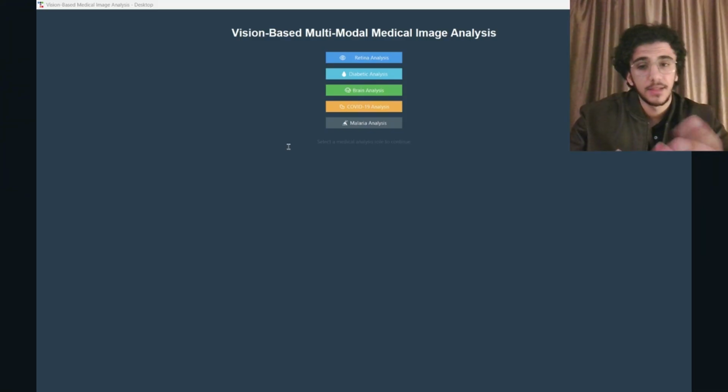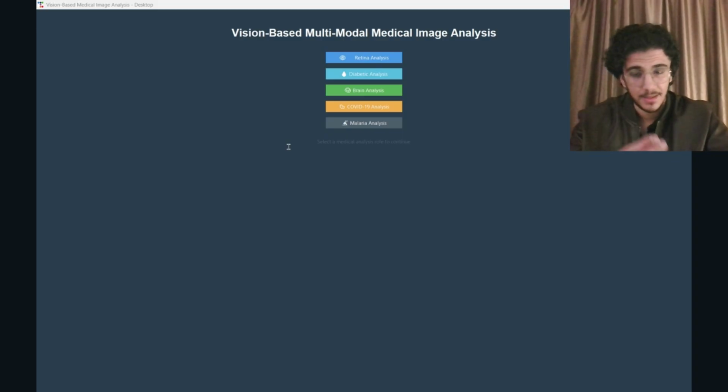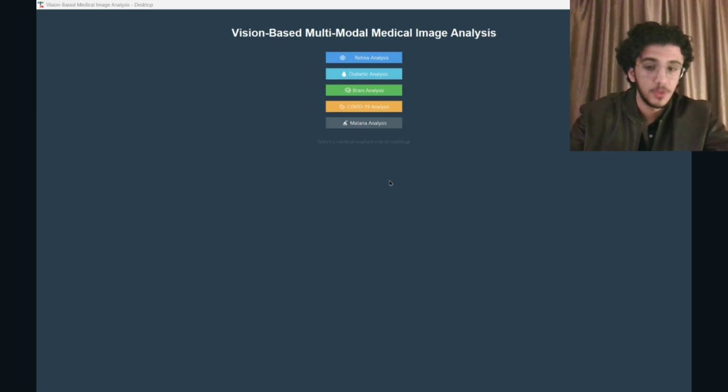My AI and new machine vision. My new AI is a multi-model retinal disease detector combining EfficientNet, ResNet, and DenseNet. Instead of relying on only one model, the system shows predictions from all three, which improves reliability and reduces bias.